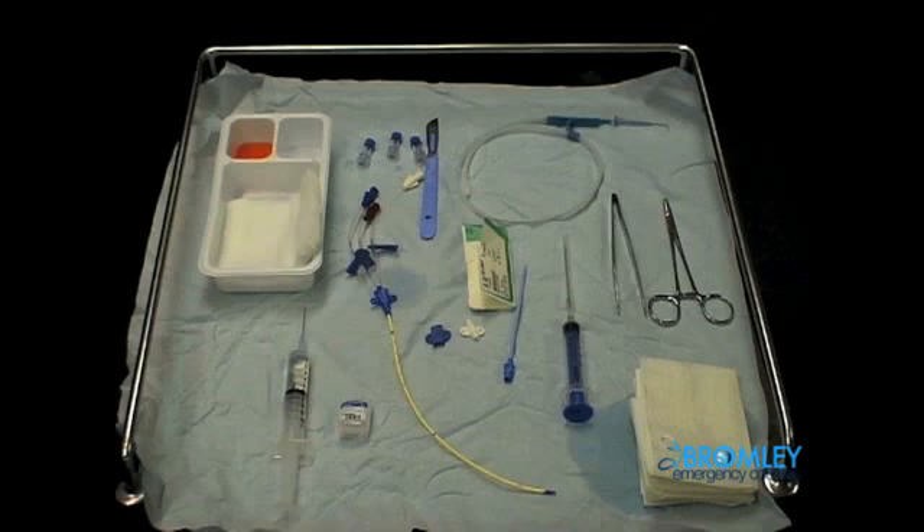Take some time now to familiarise yourself with all the equipment seen above, as you will certainly be expected to know how to utilise all of this in the OSCE exam. Remember also that as with all procedures you will be expected to use universal precautions such as hand washing, using gowns, gloves and eye goggles.